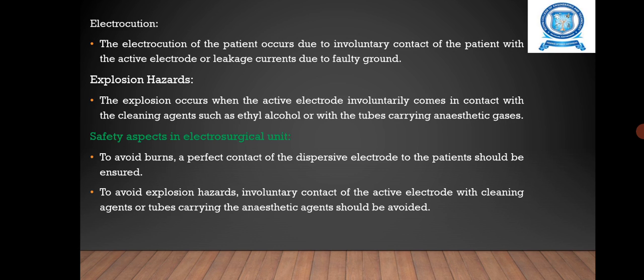Some aspects in the electrosurgical unit to avoid burns: perfect contact of the dispersive electrode with the patient should be ensured. To avoid explosion hazards, contact of the active electrode with cleaning agents or tubes carrying anesthetic agents should be avoided.